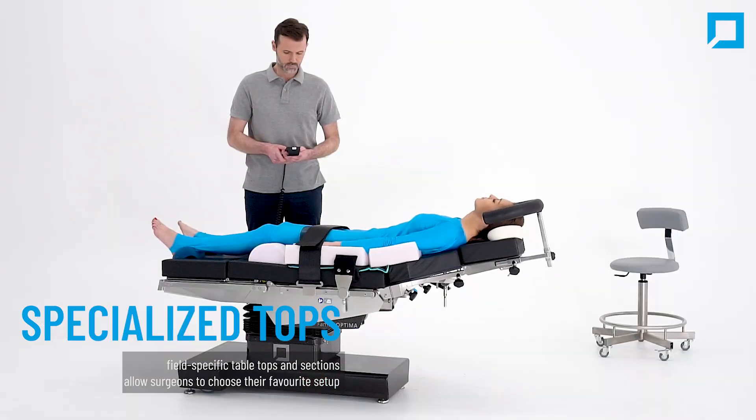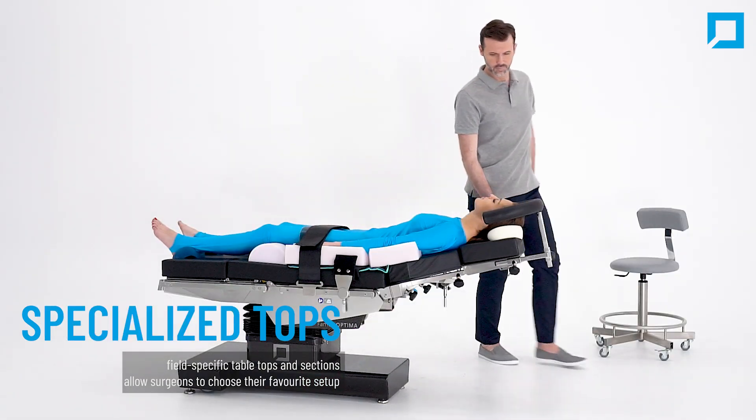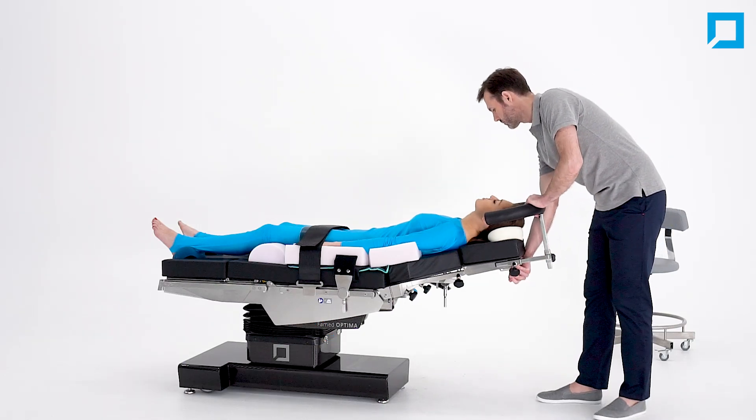You can choose your desired specialized top. Field-specific tabletops and sections allow surgeons to choose their favorite setup.